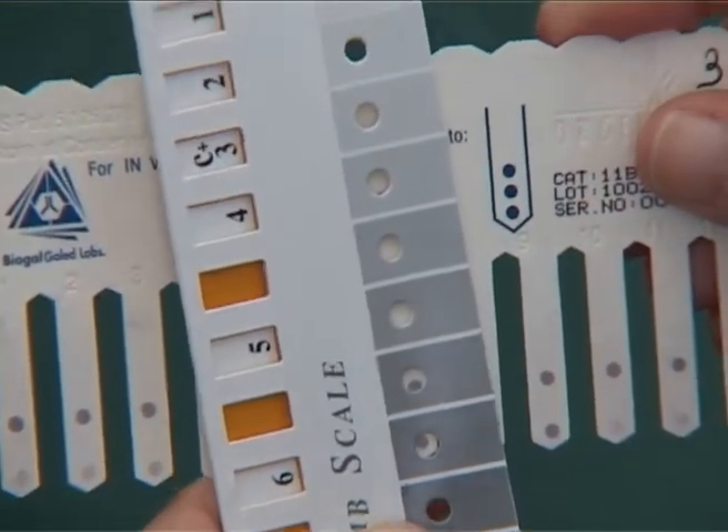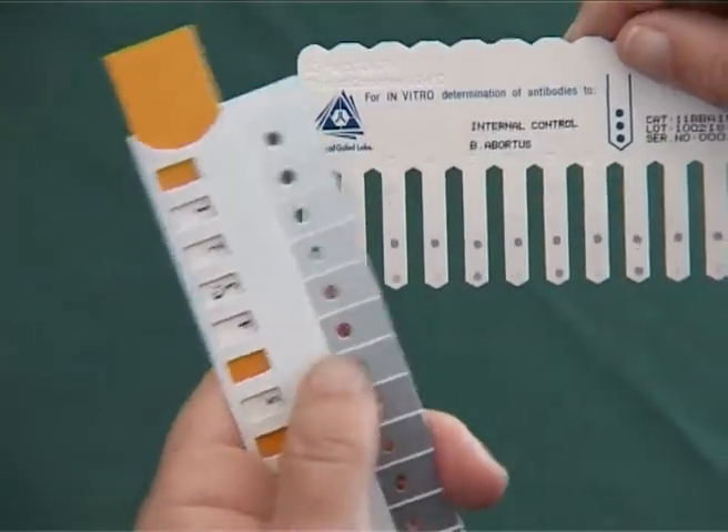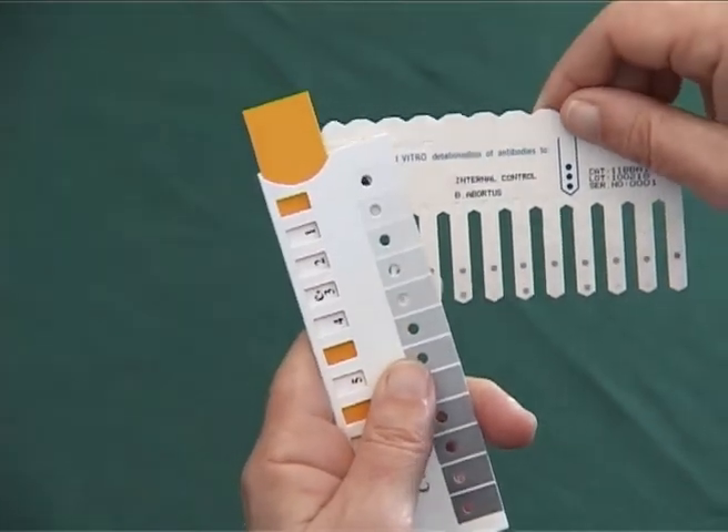Finally, hold the slide in this position during the reading of the sample, and choose the most suitable color, and read the slider in the yellow window.